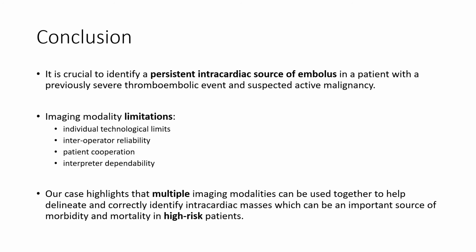Our case highlights that multiple imaging modalities can be used together to help delineate and correctly identify intracardiac masses, which can be an important source of morbidity and mortality in high risk patients such as this one.